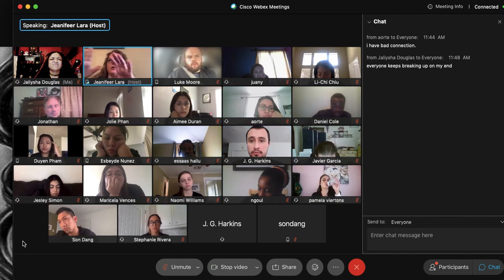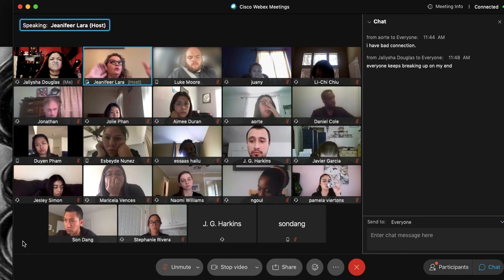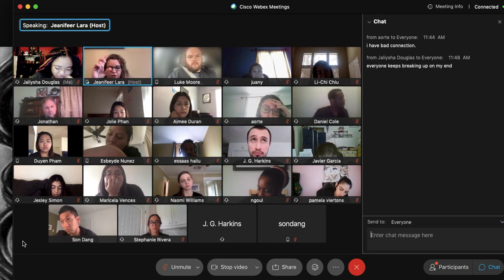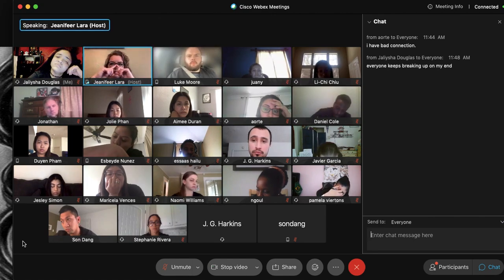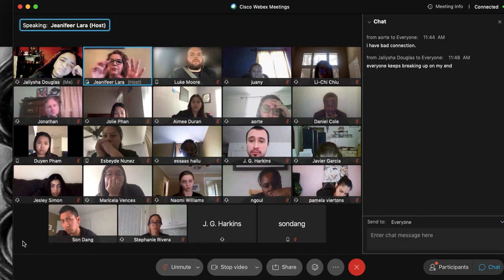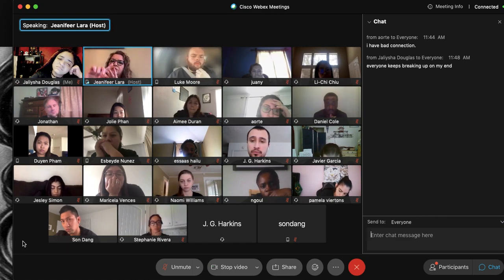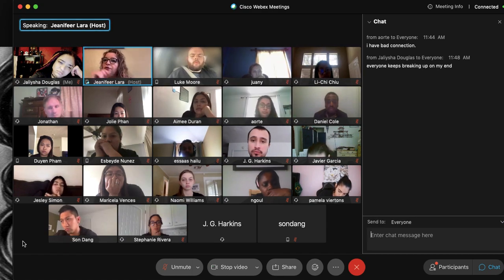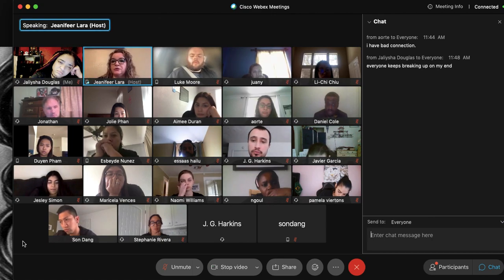Remember, because we want the smaller one. It's been a long time. The larger one is going to produce more electrons, boil off more electrons, more photons, and so on and so forth. But when we're choosing the small one, we're usually choosing a small objective, whether it's a finger, a nose, or a hand. Why do we want to choose the smaller filament? Because we want to see better spatial resolution or detail of the object, because it's so small. With a larger object, you want to see detail, but it's not going to be so important as with a small objective.